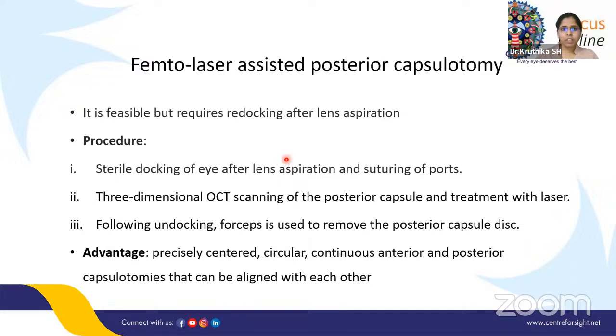So to note here, we can also use femtolaser-assisted posterior capsulotomy. There are case reports which were published recently, and it can also be used in cases of capsular blockade syndrome as well.